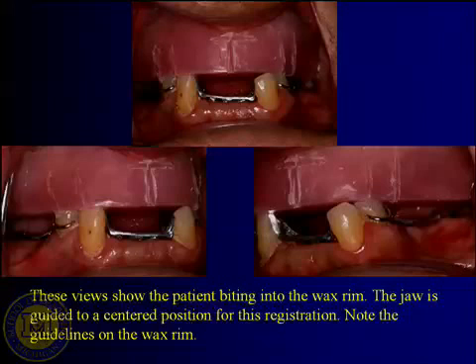What I usually use is freeway space, just a little freeway space of 2 to 3 millimeters, so from physiologic rest position, the patient can close their lower jaw 2 to 3 millimeters, and then they have tooth contact, or their teeth contact the wax occlusal rim. How do I find physiologic rest position in most patients? What I like to do is support their upper lip. So after I do my adjustment on my wax rim, I put the wax rim in many times.